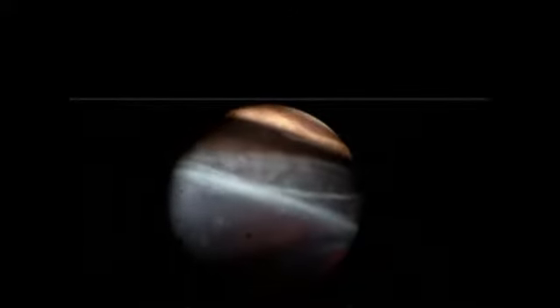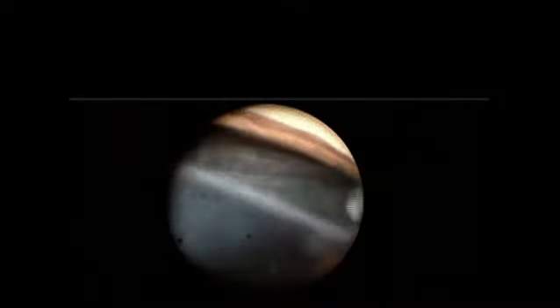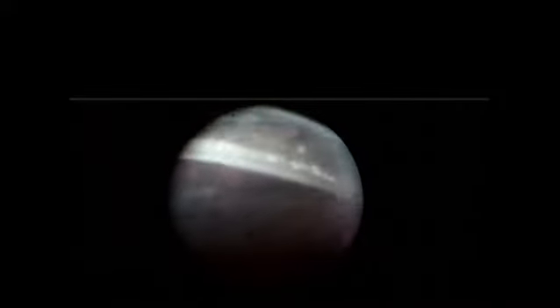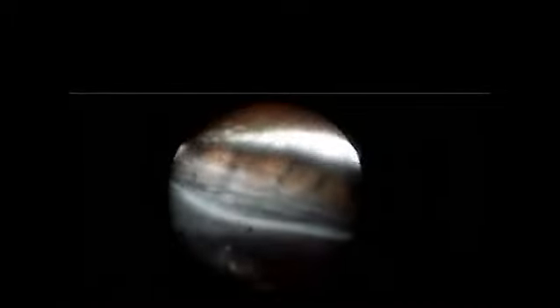The capsular bag in the area of subluxation is all wrinkled. The vitreous base can be observed where no trace of cortical material can be detected. We found the haptic loop of the IOL within the capsular bag in the subluxated region far from the ciliary processes. It was possible to conduct maneuvers to attempt to reposition the capsular ring using a Sinskey hook.